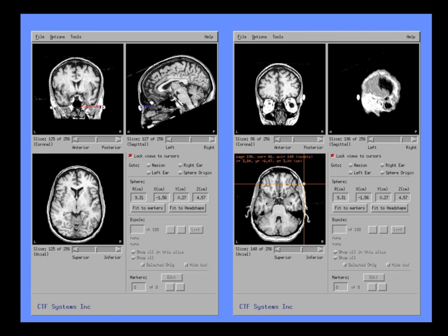So in order to be useful, you want this anatomical brain scan. So you want a good structural. We need it for two reasons. One is because we want to do this alignment. We also need it because although the head is transparent to the magnetic signals, there's a lot of the return currents are in the skull themselves, and that has to be modeled in order to solve our problems for taking the signal that's out here and getting an idea of where the current distributions are inside the brain.